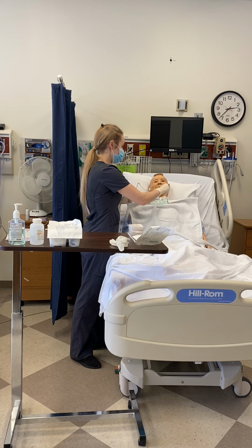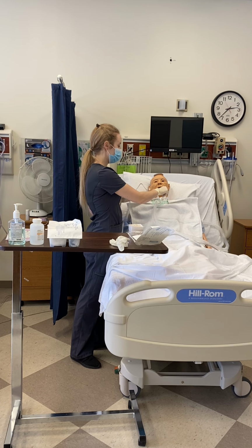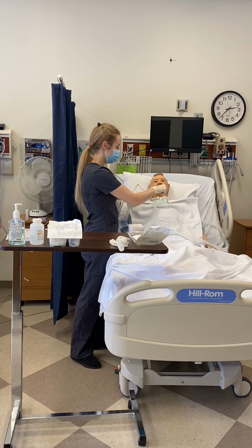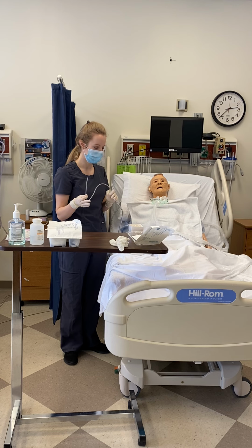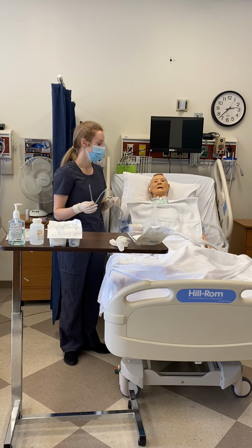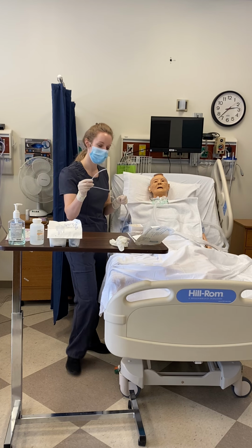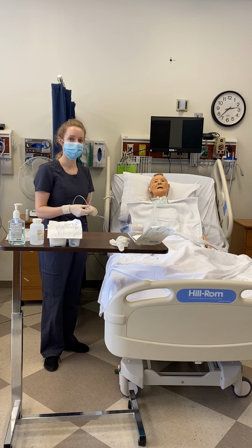But I'm going back in, again, 10 to 15 centimeters, pulling back about 2 centimeters before I apply suctioning for about 10 seconds. So I can do this for a few passes, but I don't want to go for more than about 5 minutes total. And when I'm done, I clean out my tubing and I turn off my suctioning.